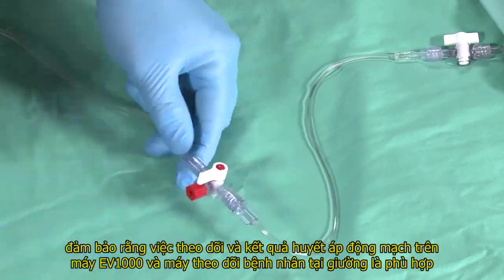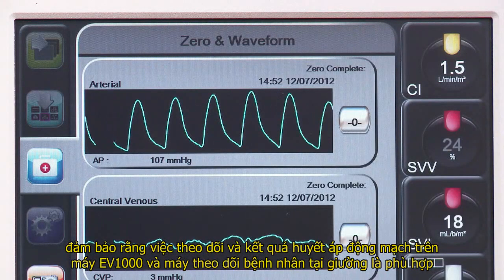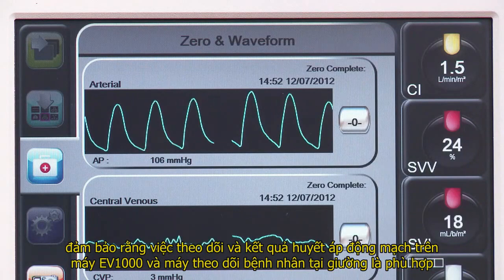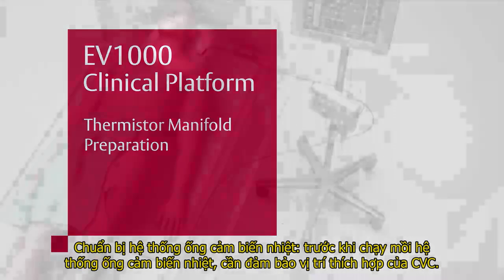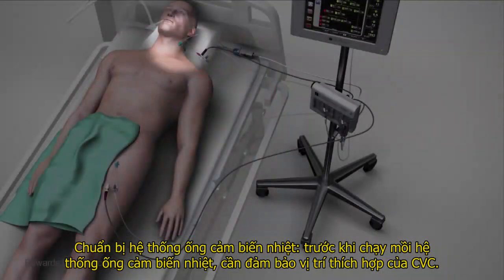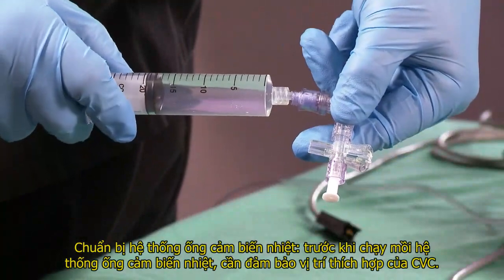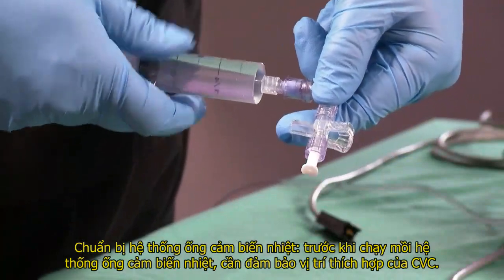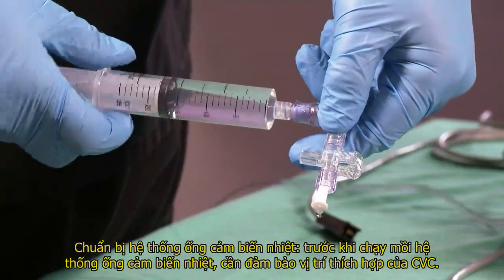Confirm that the appropriate arterial pressure tracing and reading is on the EV1000 clinical platform and the bedside monitor. Thermistor manifold preparation. Before priming the thermistor manifold, confirm the proper placement of the CVC. Prime the thermistor manifold with normal saline using a Luer lock tip syringe. Prime both ports to evacuate air.